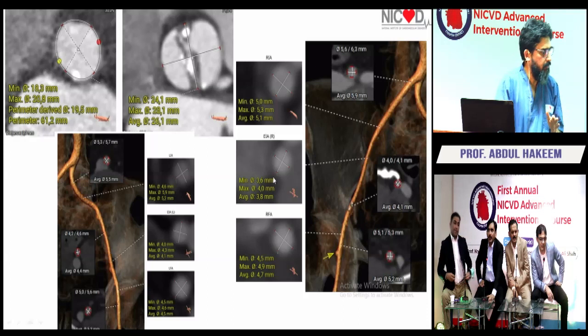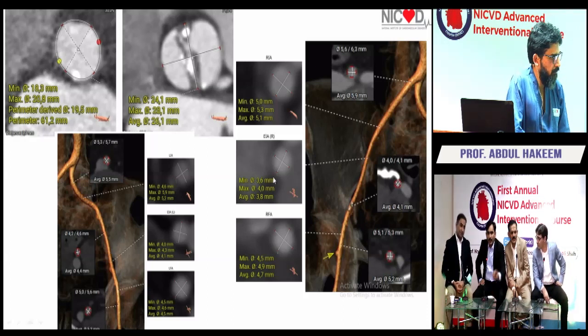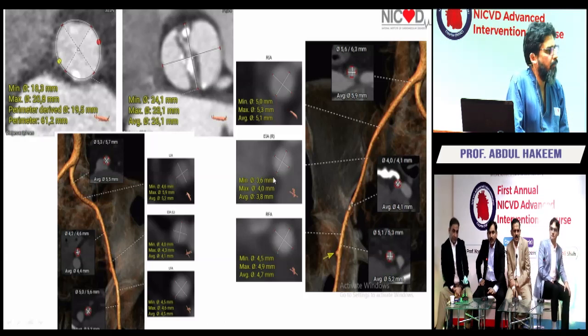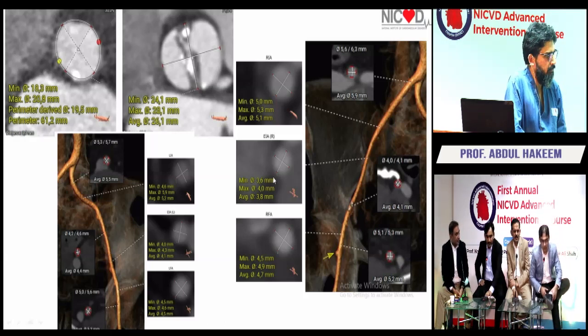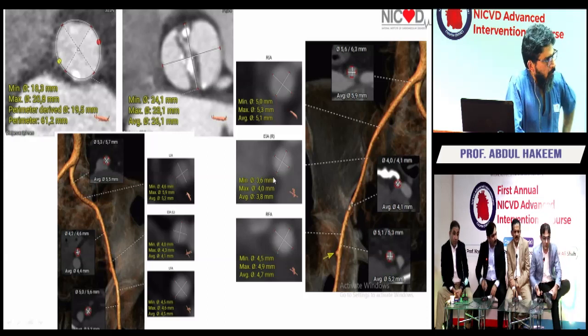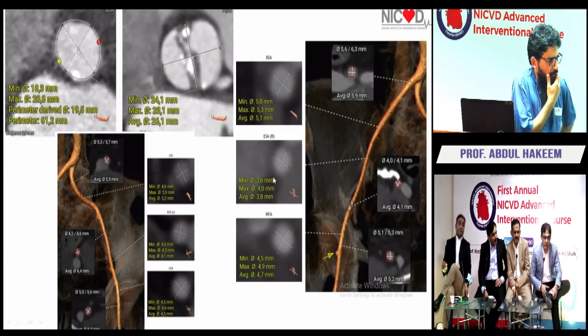I think you would ask about the ProGlide. We can just go with the one ProGlide because the vessel size is small. What do you think? Would you use? I think one ProGlide. I mean, that's what I've seen. It worked just fine, instead of using two pre-close devices. Once you choose the site, you can go in and put a pre-close device. We'll just go with one device, because if you put two, I've also seen patients where you completely shut down the vessel after you're done with your TAVR, and then we'll take it from there.